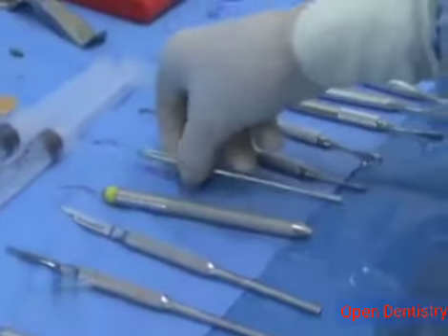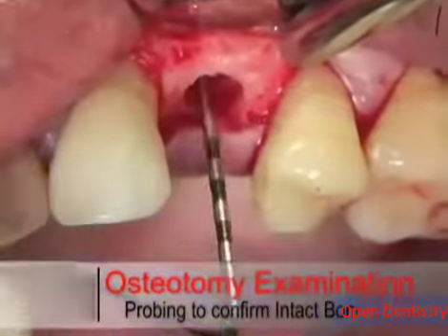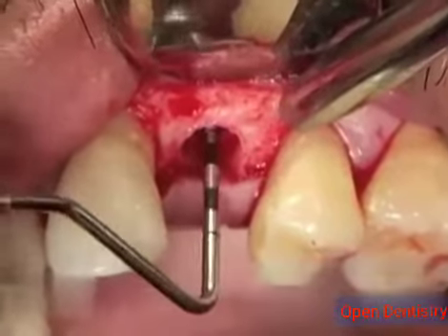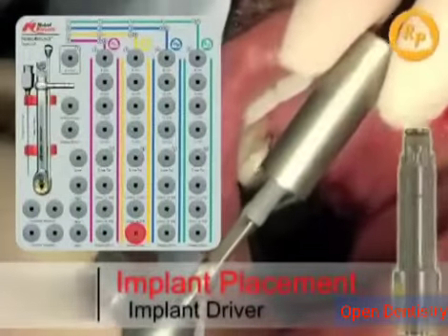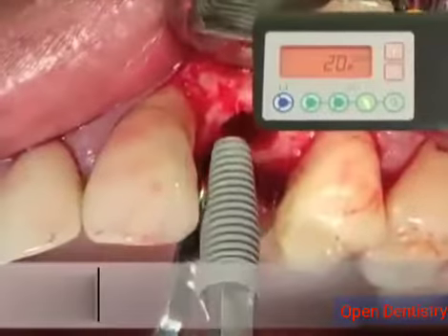An instrument is used to confirm that the bone osteotomy and the bony walls are intact, and that no perforations or anatomical limitations are there. Then the implant is picked up with a long shaft implant driver. The implant is pulled out of its titanium sleeve and then positioned in the osteotomy.